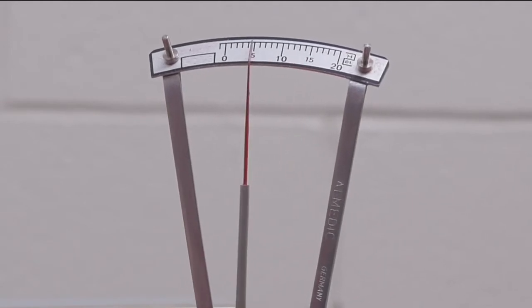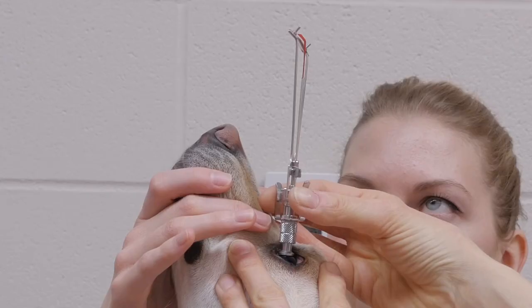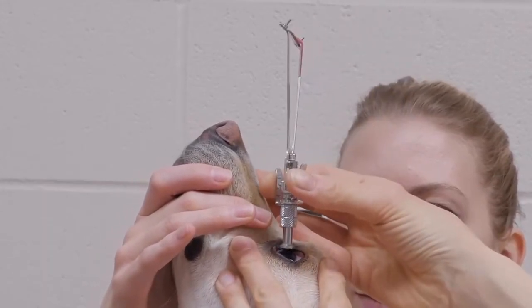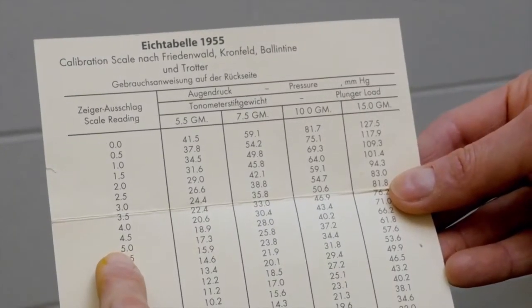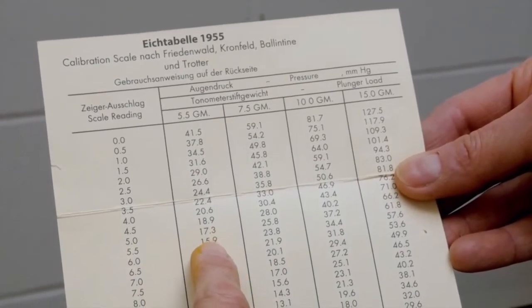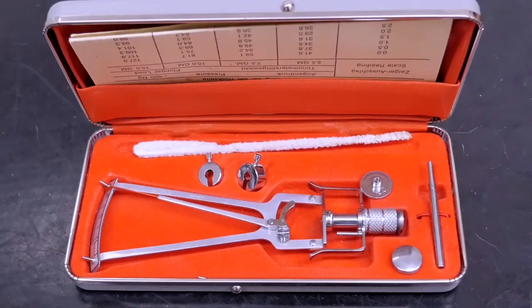This entire procedure should be repeated 3 to 4 times, and the readings obtained should be averaged. It can often be helpful to have the assistant who is restraining the animal watch the needle and take the readings. This allows the examiner to gently hold the eyelids open and to focus on proper perpendicular placement of the instrument on the cornea. The intraocular pressure is then obtained from a table that converts the scale reading from the tonometer to the intraocular pressure via the appropriate weight column.